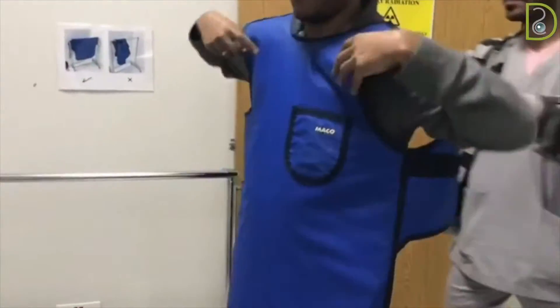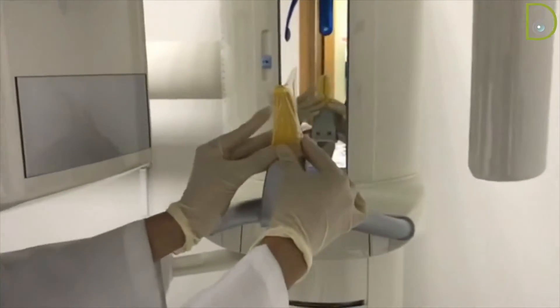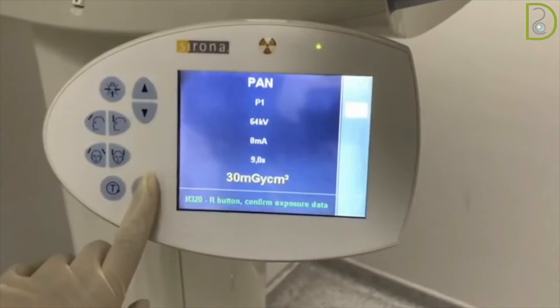Ask the patient to wear the lead apron. Place a protective barrier over the bite guide. Press the restart button on the control panel.